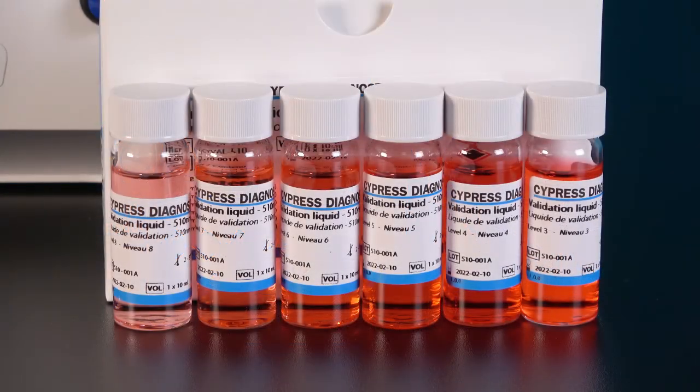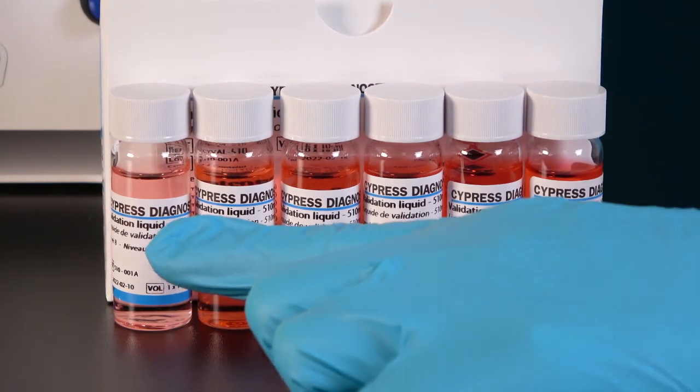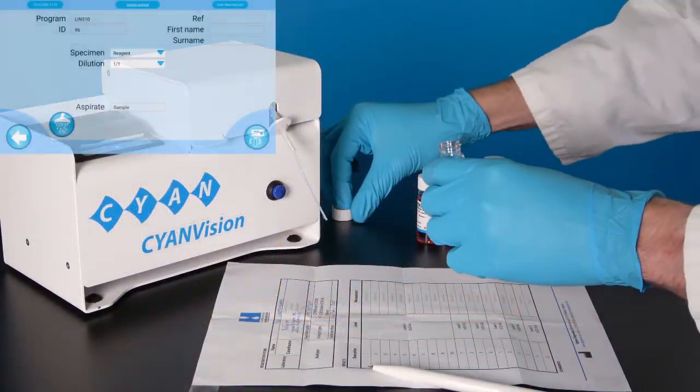You must measure all six levels to run a valid conclusive optical validation, from low concentration to high concentration. We start with level 8.